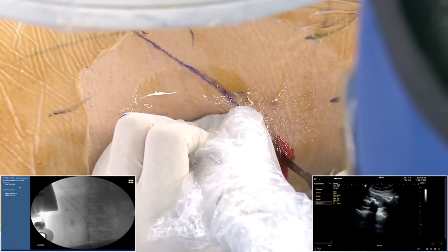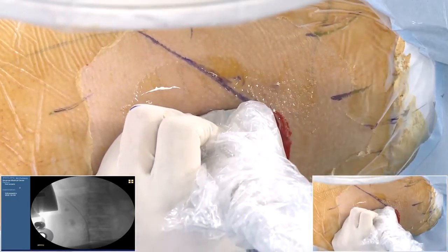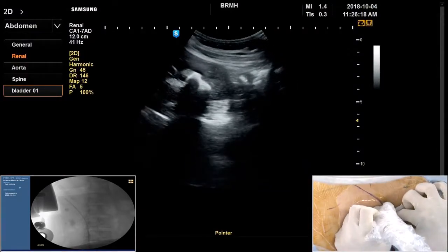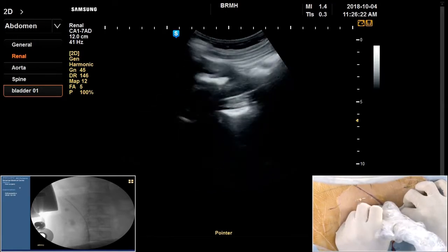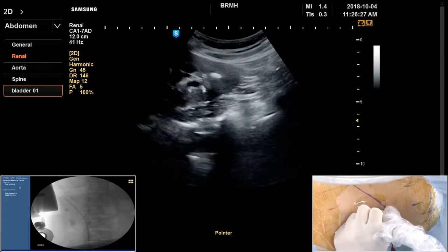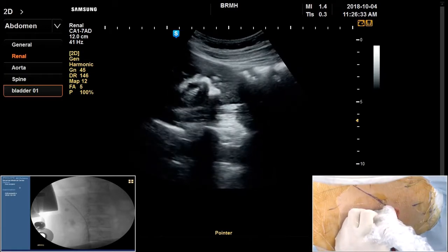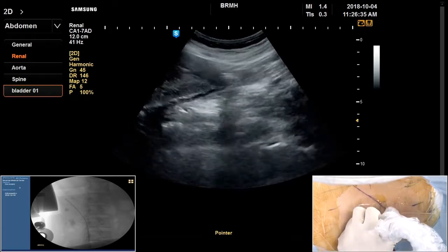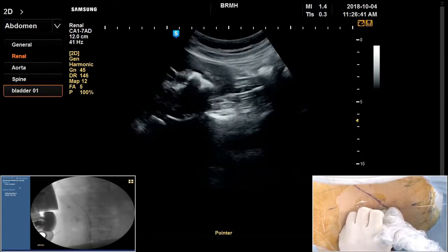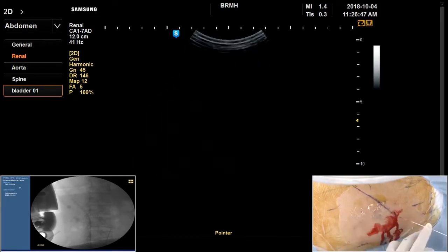Do you always do ultrasound guided puncture, or do you sometimes do fluoroscopic puncture? Yeah, basically I started the puncture with fluoroscopy, but from 2 years ago I tried to use the ultrasonography as much as possible. May I ask the audience, who is doing ultrasound guided puncture? Hand sign, please. Okay, not the majority. And who is only doing it with radiographic puncture? And who has the radiologist place the puncture? Okay, very good.